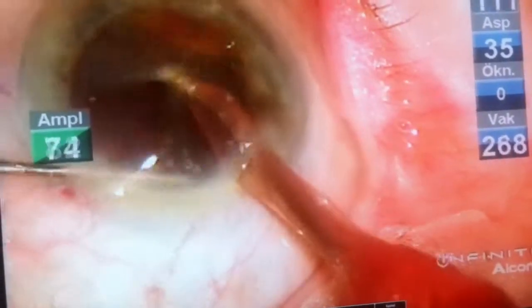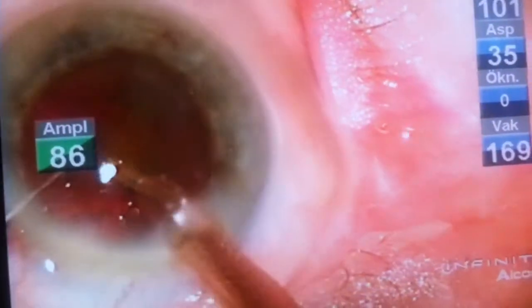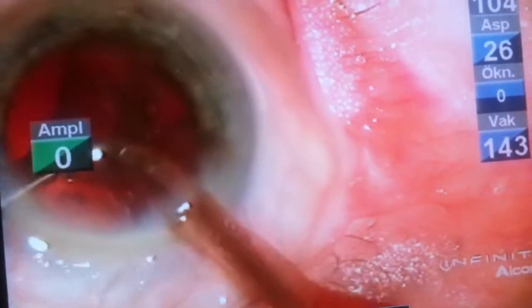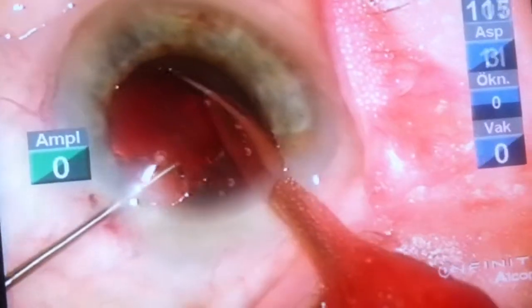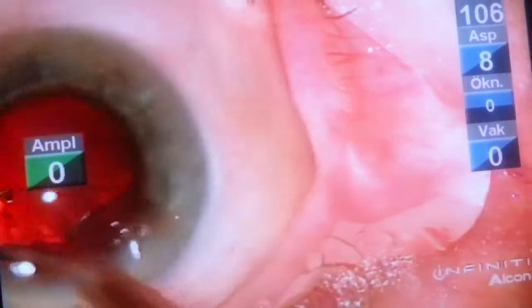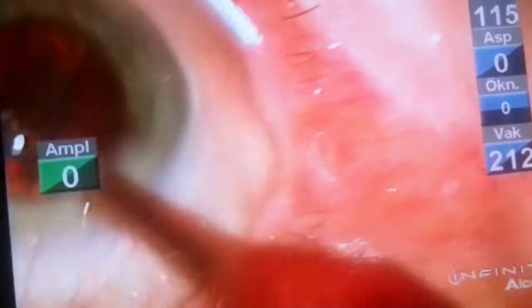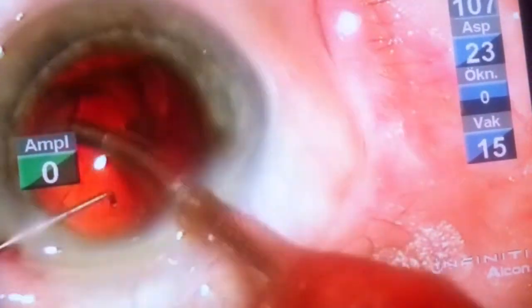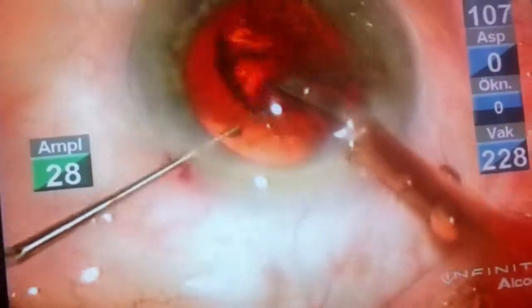The Infinity phaco machine has very efficient phaco dynamics and the hard pieces disappear very quickly. Now we are removing the epinucleus, which is hard as well and can sometimes be tricky, so take your time and carefully capture the edge of the epinucleus or the remnant cortex, always working centrally without chaotic movements.